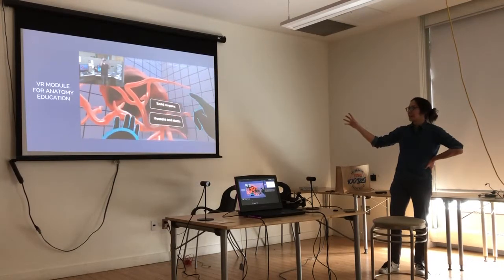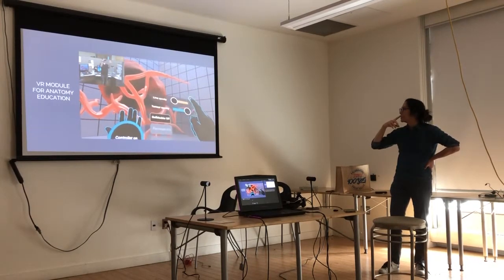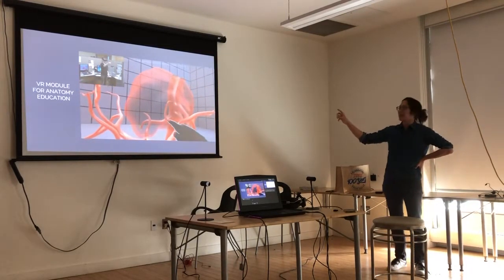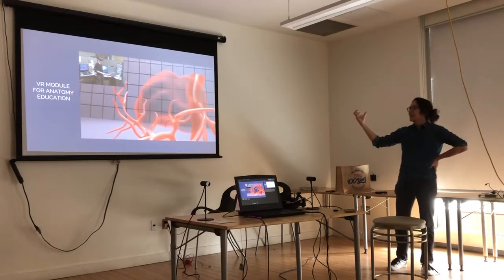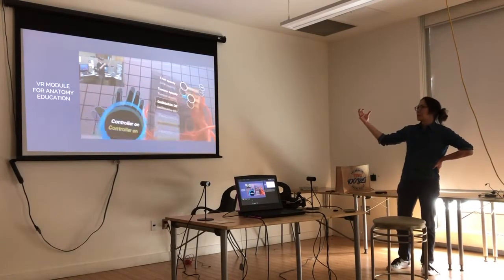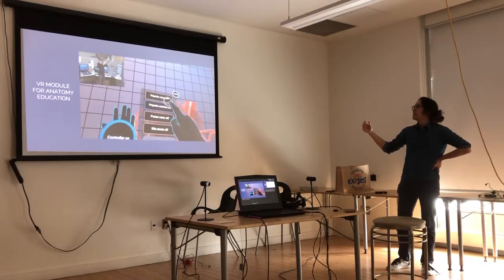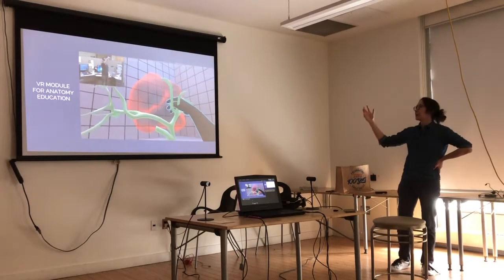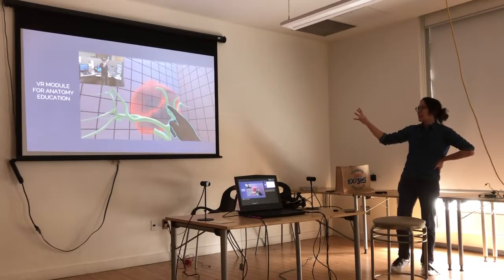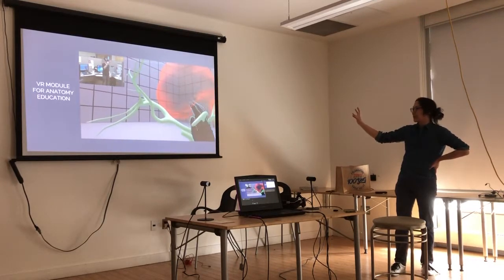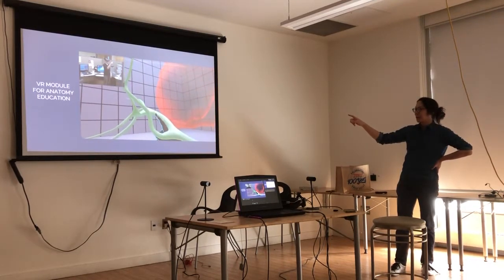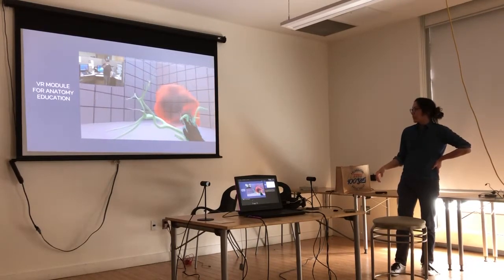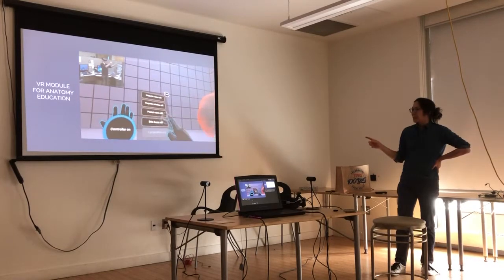We can start thinking about what exactly we're resecting and look at the arteries — that's the main hepatic artery carrying blood to the liver. You can see very clearly some of it is affected by the tumor and some is not. We can see through the tumor to look at the small branches already affected within it. And the bowel — we can look at where it goes. It goes around the tumor, so it's not exactly affected, but it is very close, so that's something surgeons may have to look after. This is where the tumor affects the body the most — it actually envelopes a little section there in the middle.